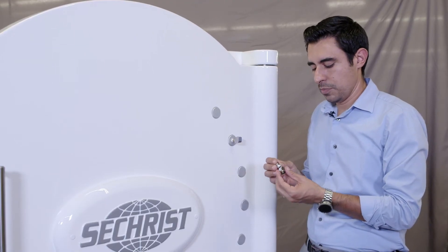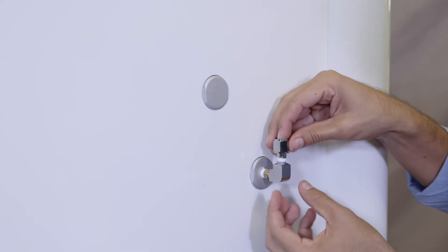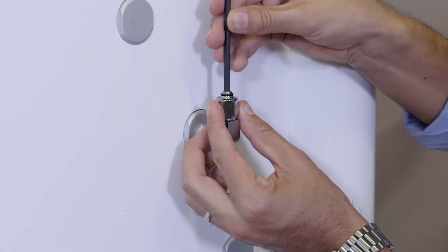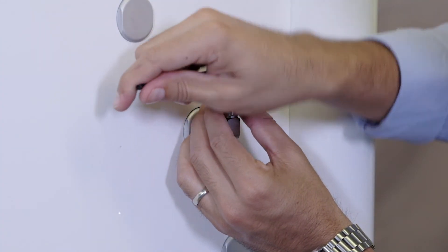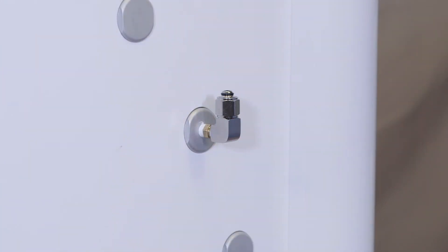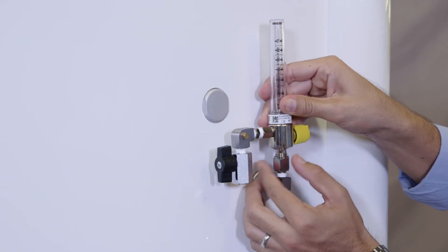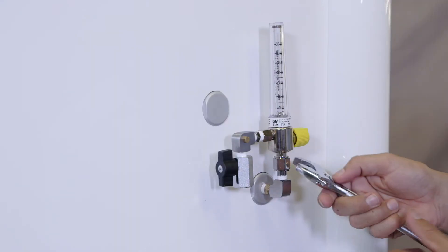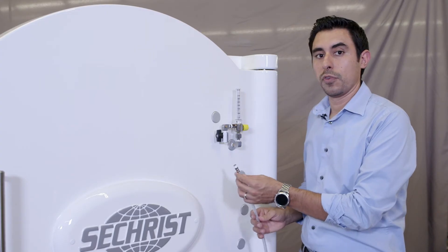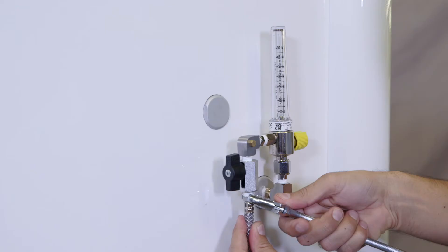Install the DISS nipple into your DISS nut before installing into your elbow fitting. Use a 3/16 Allen hex to finish installing the DISS nipple into the elbow fitting to secure. Install your flow meter and secure in place using the DISS nut, then fasten using the crescent wrench. Install your 40-foot air supply hose to the flow meter valve and secure using your crescent wrench.